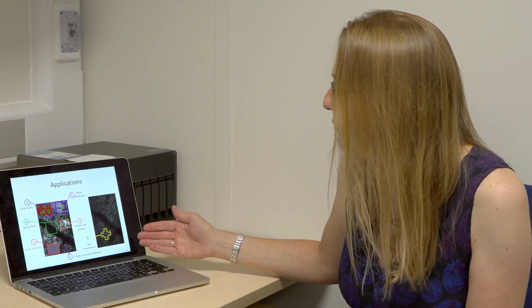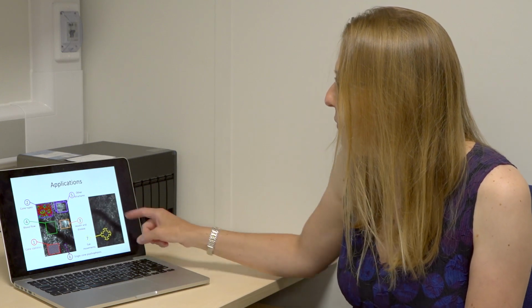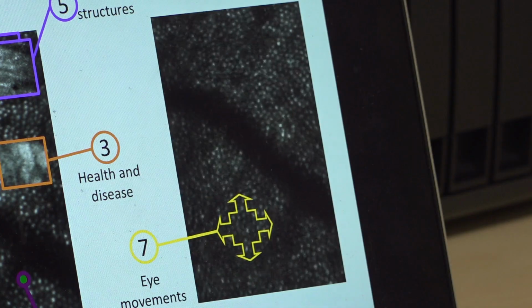We mentioned one of the challenges of this sort of imaging being the fact that the human eye is always in motion. As well as that being a challenge, it's also an open question in research. So why does the eye move all the time, and in what way does that impact our ability to see? One of the fundamental things we know about vision is that if we suppress these eye movements, if we stabilize the image on the retina, then vision fades to nothing. So it's fundamentally important that the eye moves in order for us to be able to see at all.